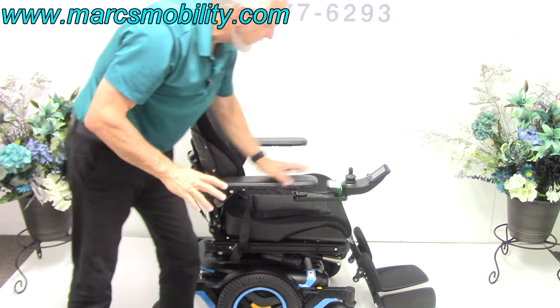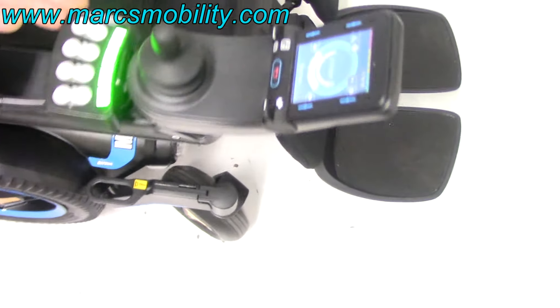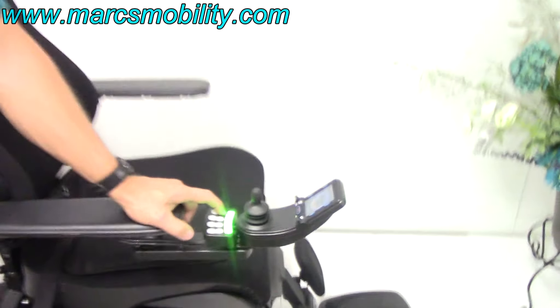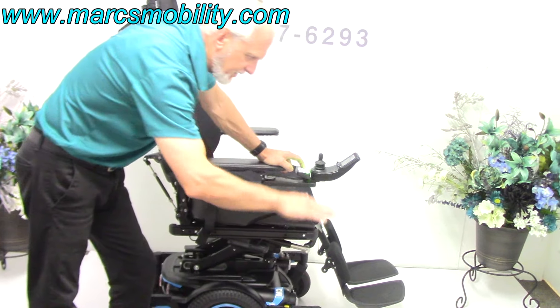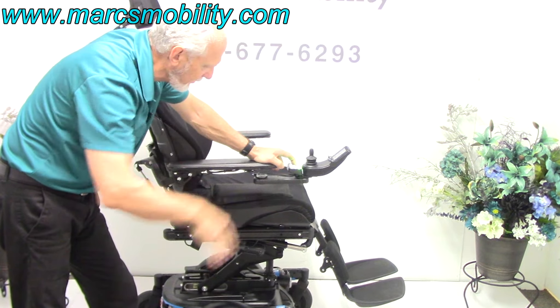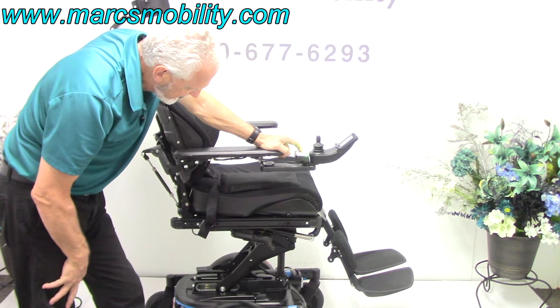You can work all five functions through the joystick or through the switch box back here. I always use the switch box. The first button is the seat lift — if I push this down, you'll see the 12-inch seat lift. You start at about 22 inches; by the time you're up 12 inches, you'll be at 34 inches — eye level with someone talking to you.